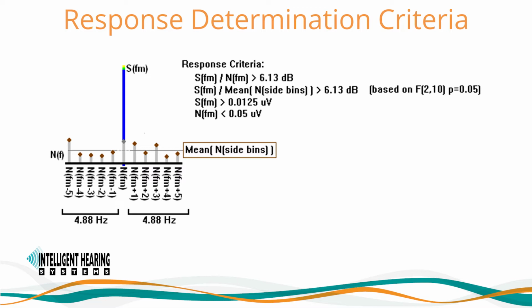Lastly, the final criteria is that the noise level of the recording measured at and around the modulation frequency must be less than 0.05 microvolts. This prevents excessively noisy recordings from being evaluated.